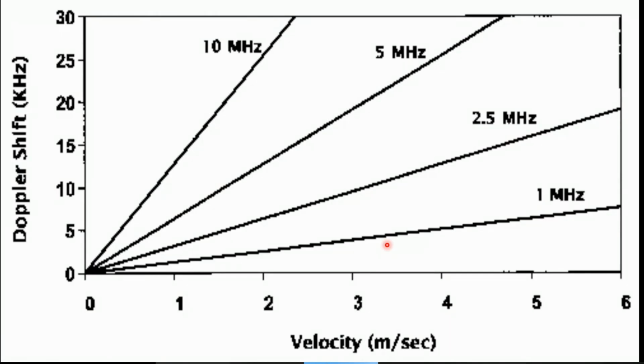So these factors are exactly opposite to those of two-dimensional echocardiography. This is called the paradoxes of Doppler. The first paradox is that Doppler works best when there is parallel echo beam orientation or alignment as compared to the flow of blood. The Doppler measurements are accurate when the echo beam is parallel to the flow of blood.